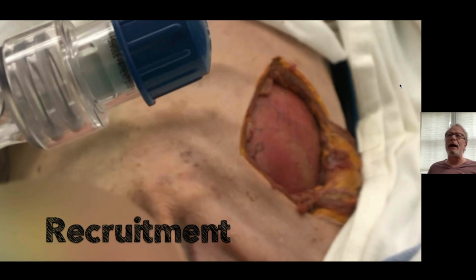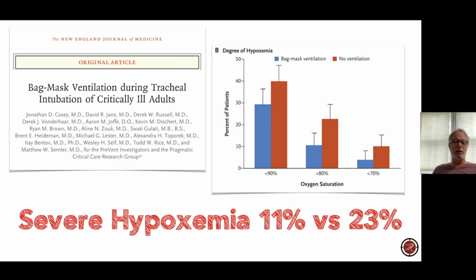After 3 breaths, with an FiO2 of 100% and adequate flows, you're really not affecting their oxygen much. You're just affecting their CO2. I'm not saying during that period just give 3 breaths because that's really hard. What I'm saying is don't overventilate the patient. Limit it to 10 and be careful with it. Gentilate them during that period of time.